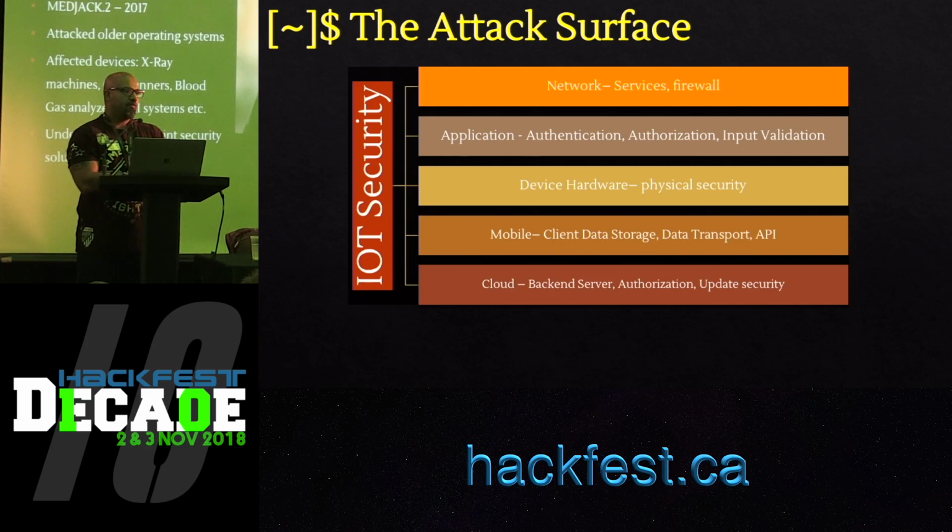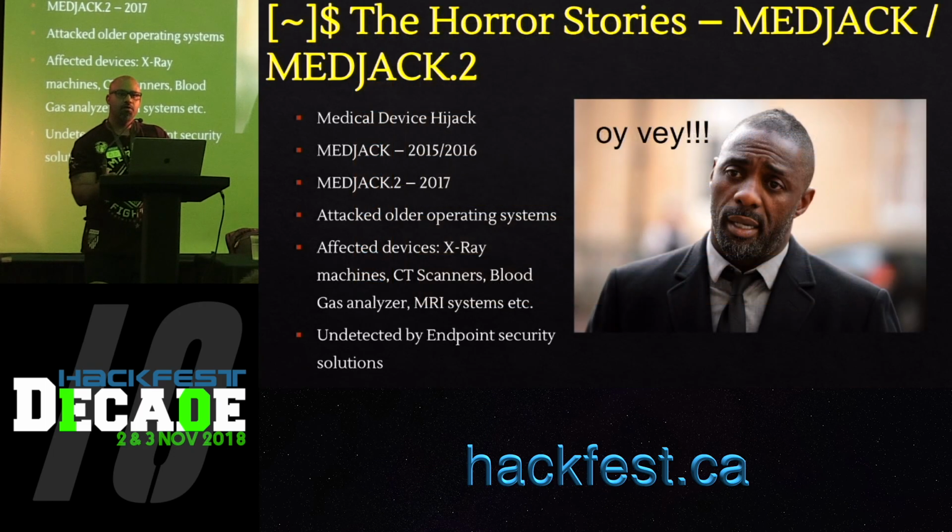So there have been a lot of horror stories or incidents associated with connected medical devices. I specifically wanted to talk about Medjack and Medjack 2 because they had the most impact. They were the most noticeable among others. Medjack, or medical device hijack, was malware that came out in 2015 and lived through 2016. Medjack 2 is basically a more evolved and sophisticated version of Medjack. It came out in 2017.